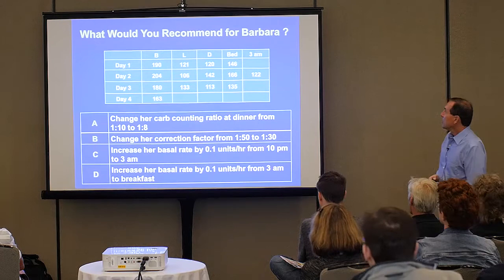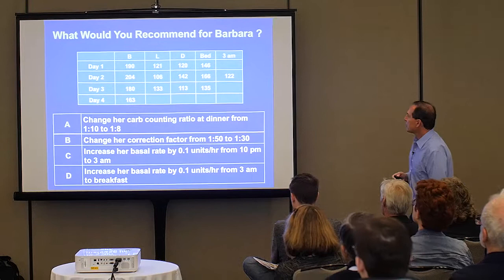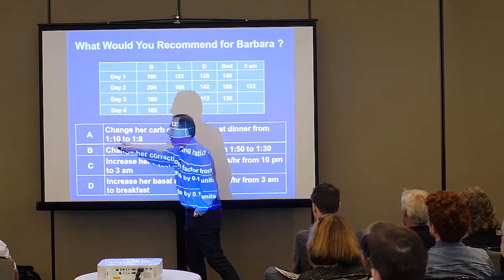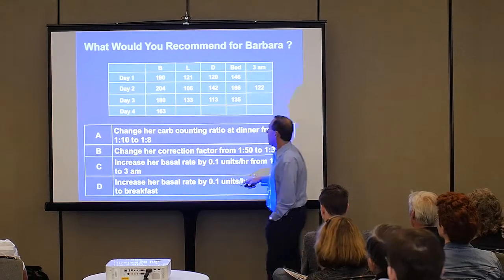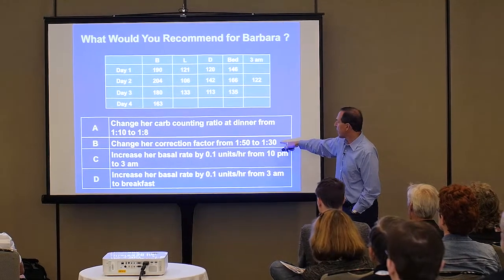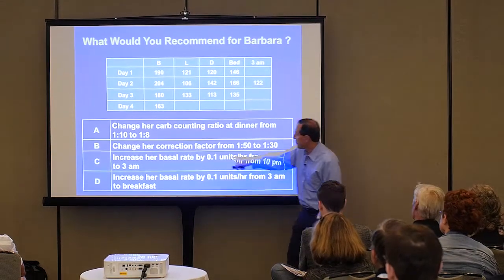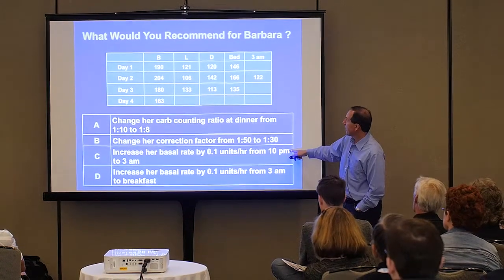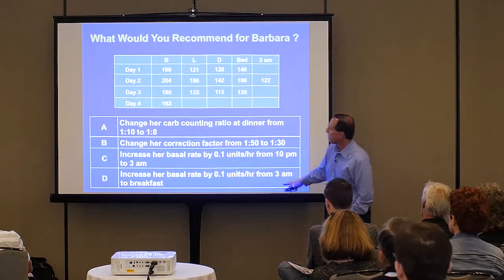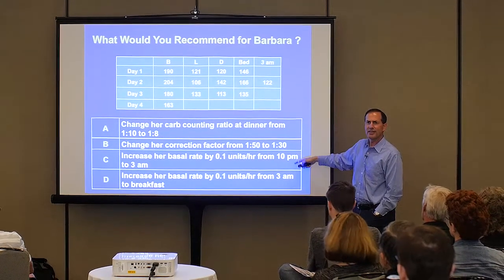Okay. Now, you're her doc. It's not enough to identify the problem. You have to help her. So how are you going to help her? Are you going to change your carb counting ratio at dinner to make it stronger so she gets more insulin? Are you going to change your correction factor to bring her down better from a high? Are you going to increase her basal rate by 0.1 from 10 p.m. till 3 a.m.? Or are you going to increase her basal rate by 0.1 from 3 a.m. up to breakfast? Okay, who votes for A, B, C, D?